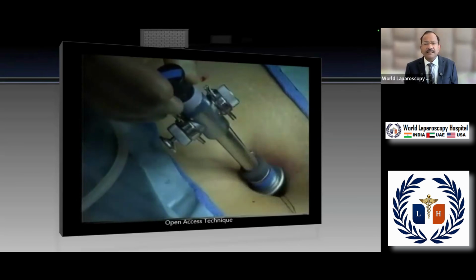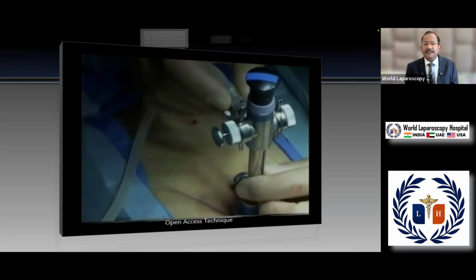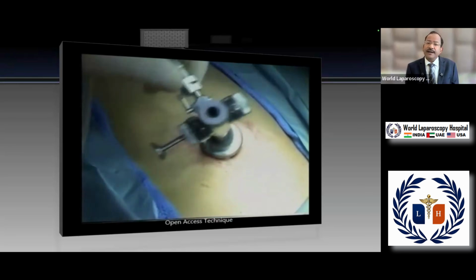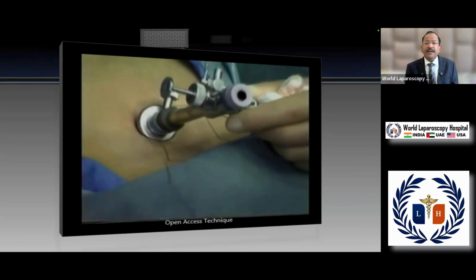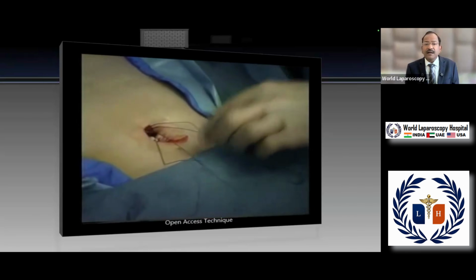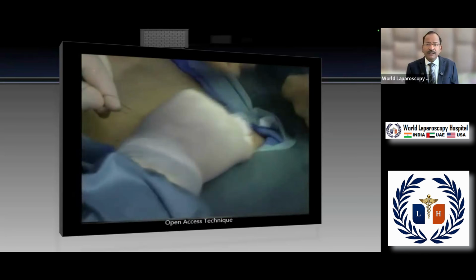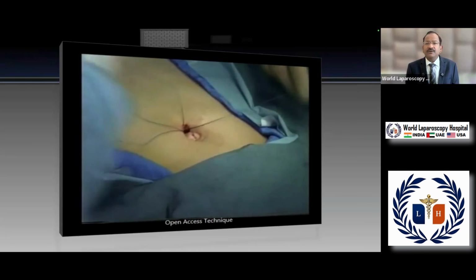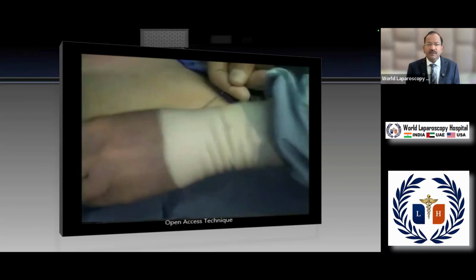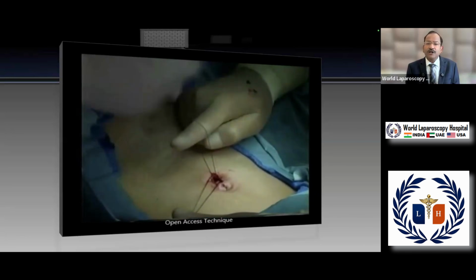And then on either side, it has a slit, and you will attach it and then start insufflating. Here also insufflation should be 1 liter per minute. The reason being, if you do rapid insufflation, it can create vasovagal shock. Now at the end of the surgery, once the surgery is over, remove the port and the same suture will be used to close the port. So you will hold it, tie a knot, and it will act as a port closure.